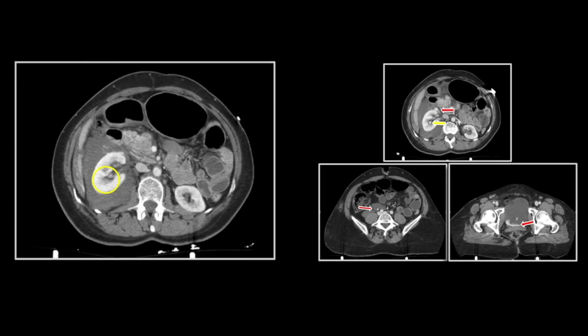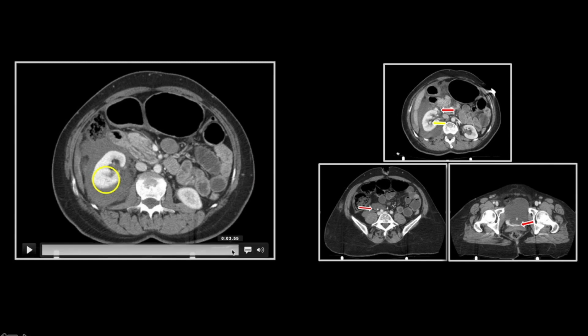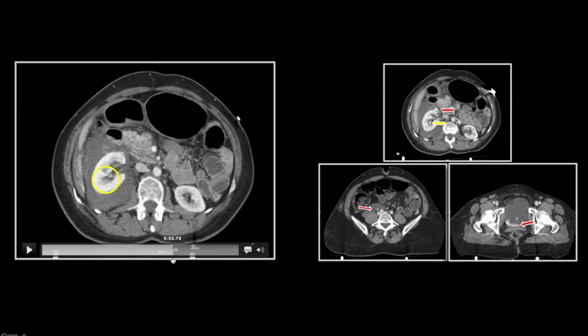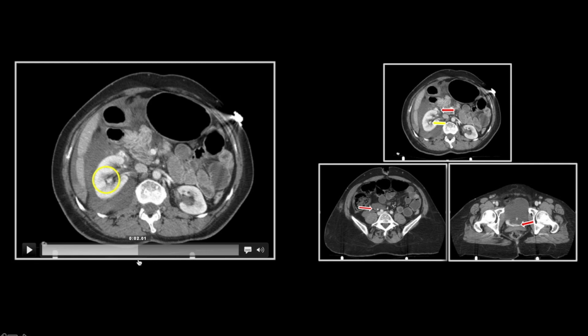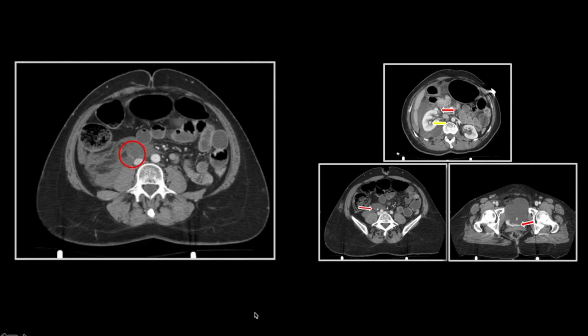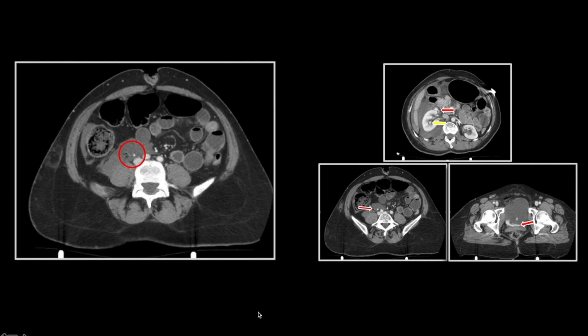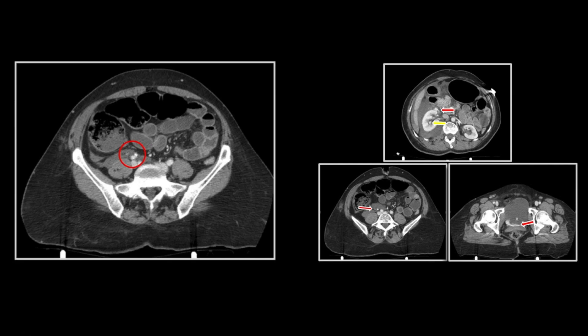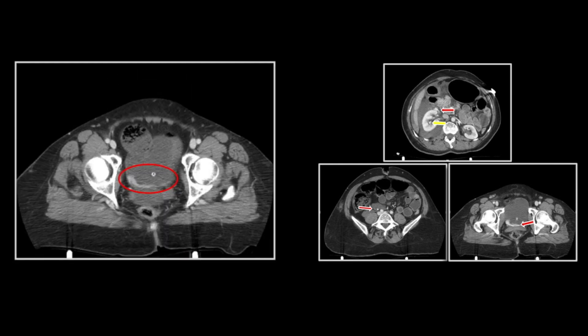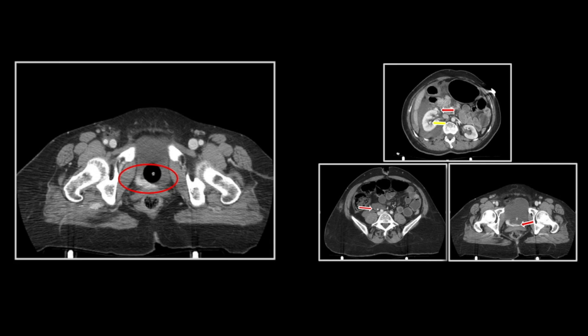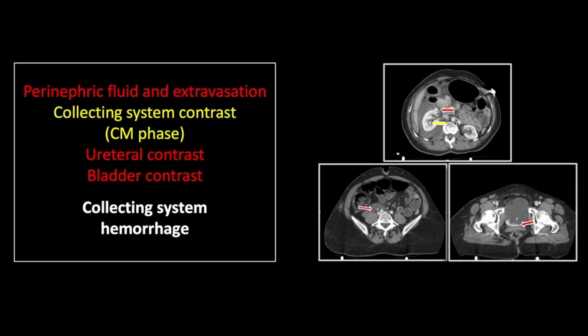Here on the CINI, you can appreciate again that hyperdense contrast within the collecting system of the right kidney, in a kidney that is in the corticomedullary enhancement phase. Here we see the right ureteral and bladder contrast. This was angiographically confirmed — an arterial hemorrhage related to a renal laceration with hemorrhage directly into the right renal collecting system.